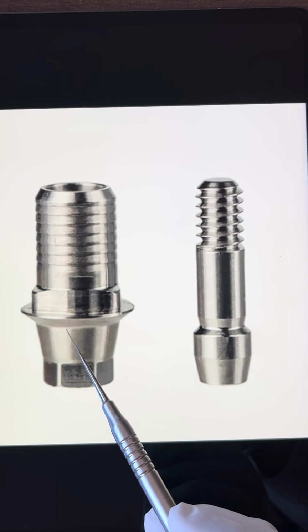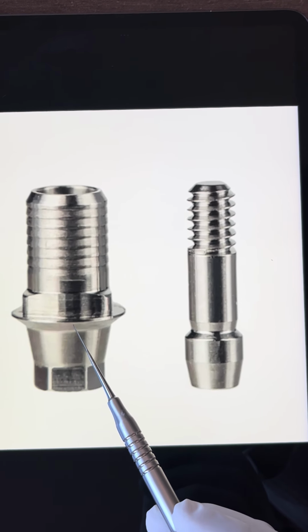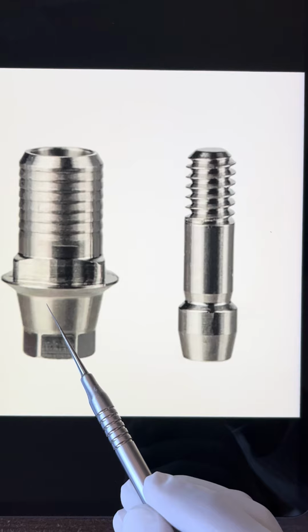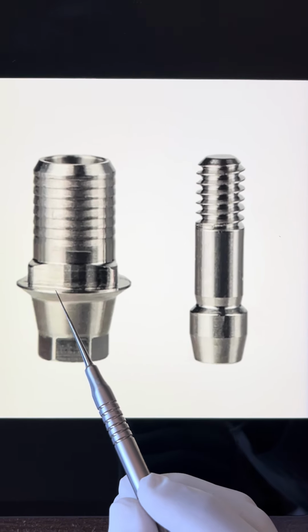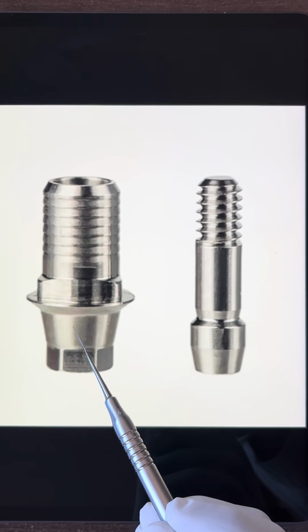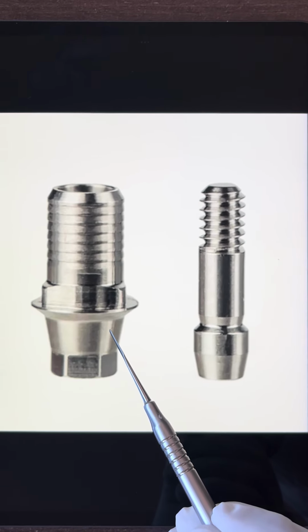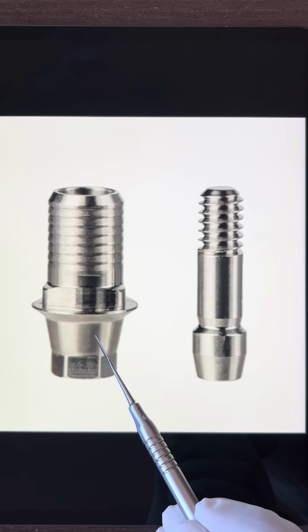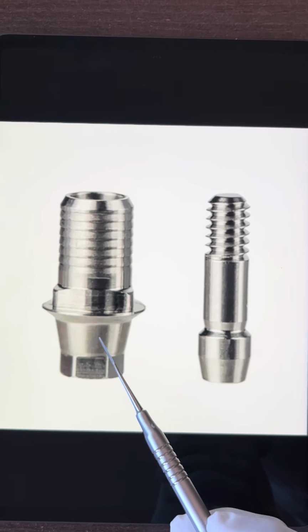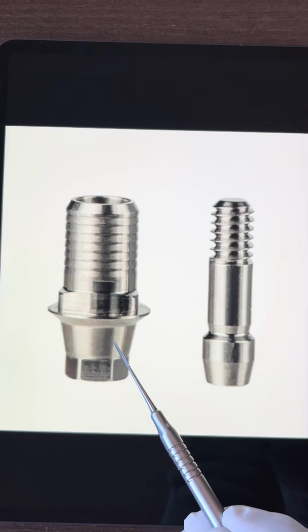It will also facilitate the digital workflow like CAD/CAM, and it will help in making a very precise and customized crown, as well as the gingival fit or emergence will also be very nice. That will promote tissue health. So this is an excellent method to go for a screw retained zirconia or ceramic crown.